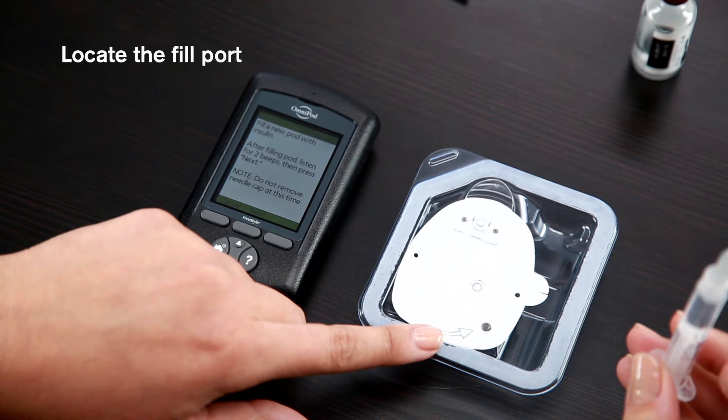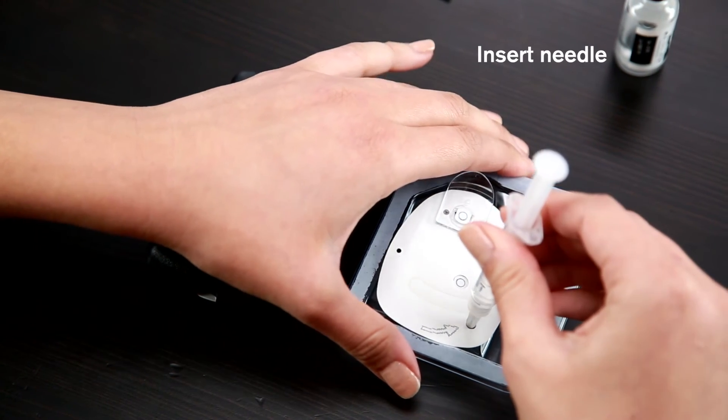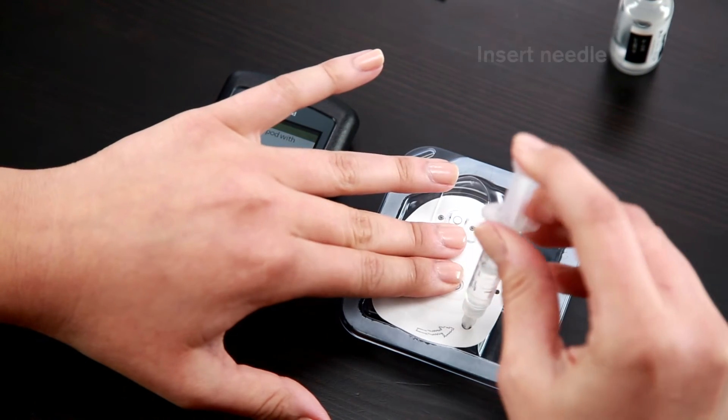Locate the marked black arrow on the underside of the pod. This is the fill port. Insert the needle straight into the fill port. It is easiest to keep the pod in its tray while filling.